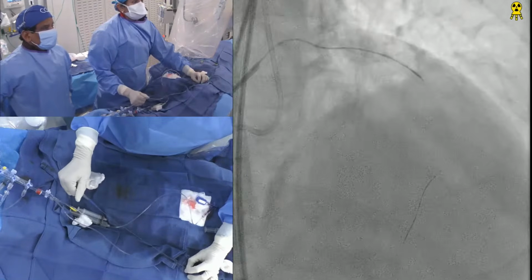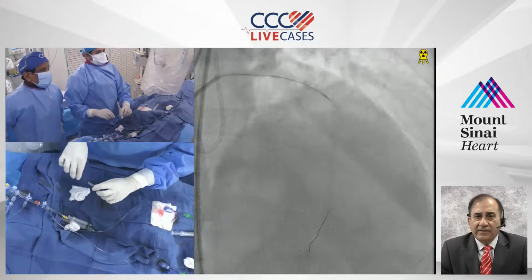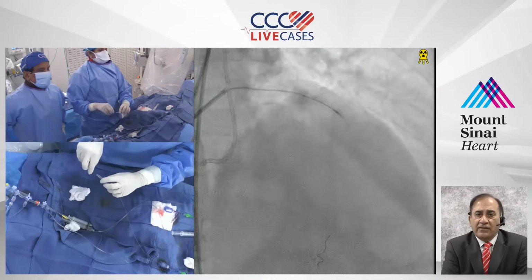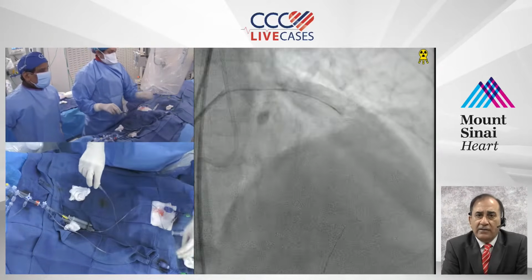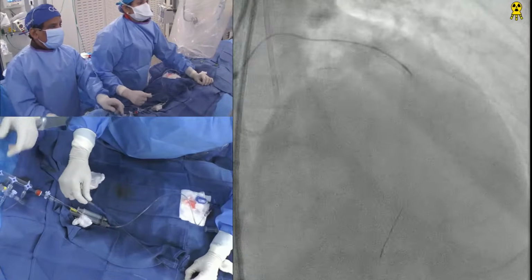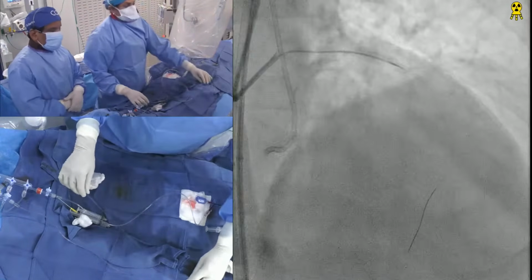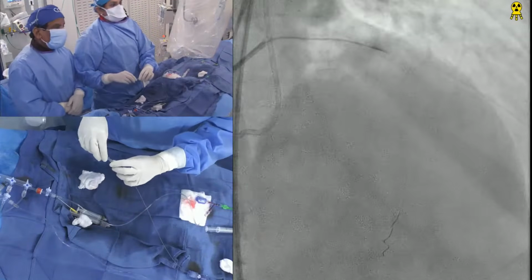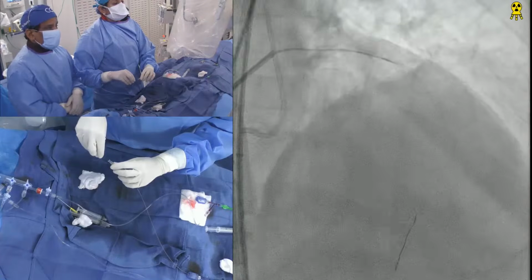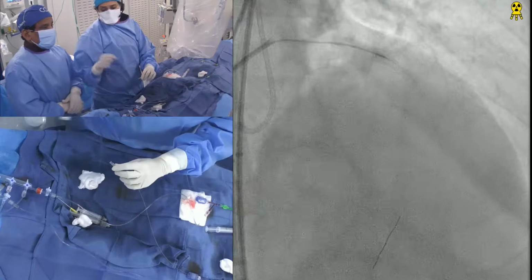Probably not. Getting stuck at the distal part of the previous stent. And the wire is beyond the stent. Turnpike, yeah, clearly. What do you think? The Corsair doesn't go. What of the turnpike? Turnpike is about 1.6 French compared to 1.8. Not even that. If this does not go, are we going to? That is exactly the distal part of that septal. It was so curly.